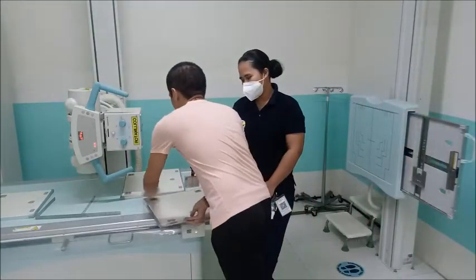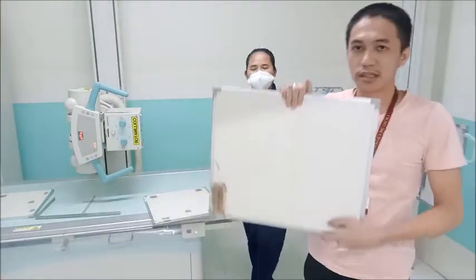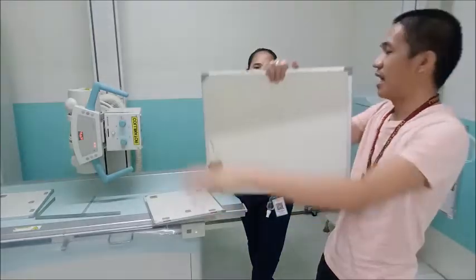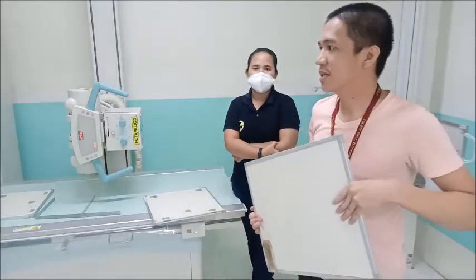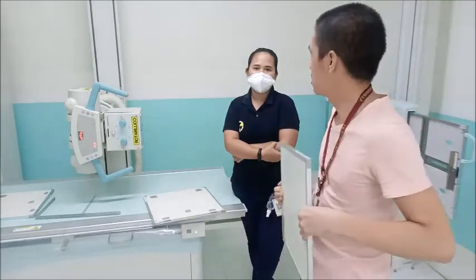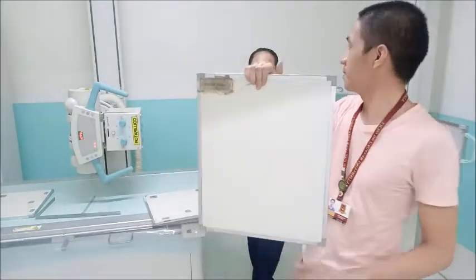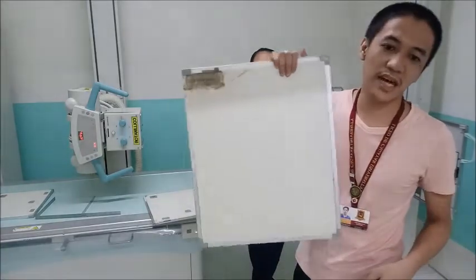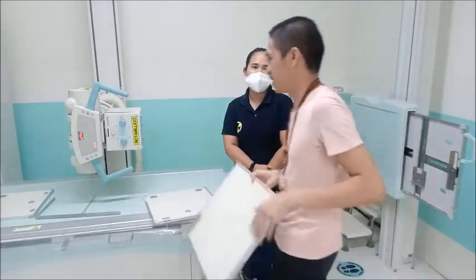So if you x-ray patients that are obese and somewhat short in stature, you can use the 14 by 17 in landscape. Okay, for the thin and tall ones, like Mahad, Lloyd, Albert, we use 14. Charles Tan is somewhat thin, right, and tall? So 14 by 17. Sam, here he is.